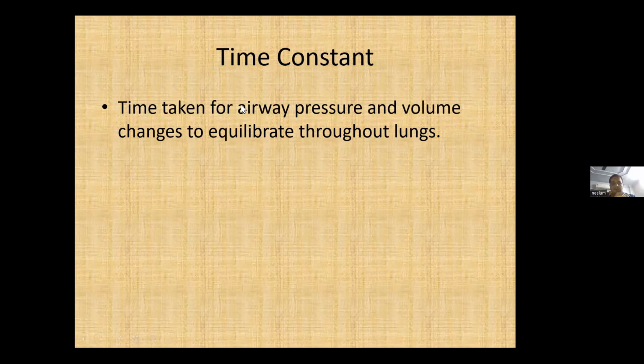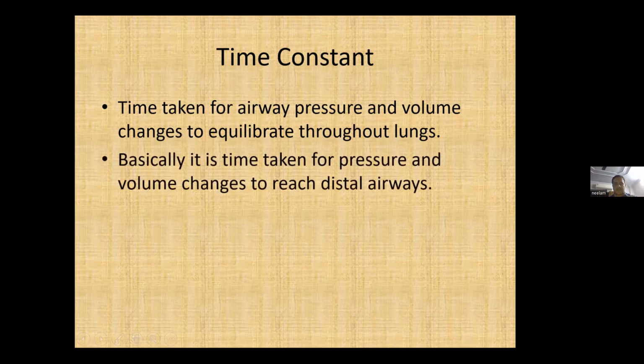It takes some time for the airway pressure and the volume changes to equilibrate throughout the lungs, okay. So that is what we call time constant. Basically, it is the time taken for the pressure and volume changes to reach the distal airways.